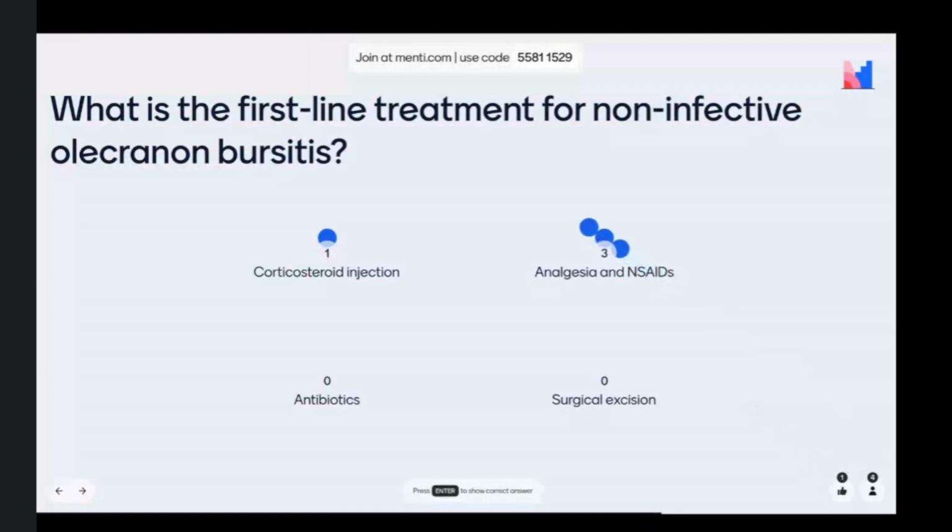Okay. So for the aspiration of the bursa, of course, we do it under aseptic conditions, and it's an immediate microscopy for crystals or bacteria to confirm the gout or bacterial infection. So after doing the aspiration, we can know if it's gout or a bacterial infection, and a small needle is used to aspirate the bursa completely.